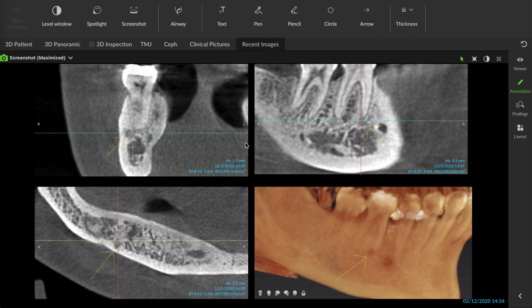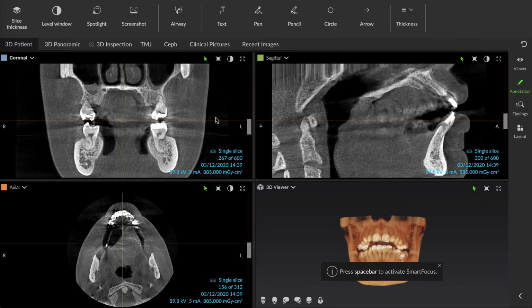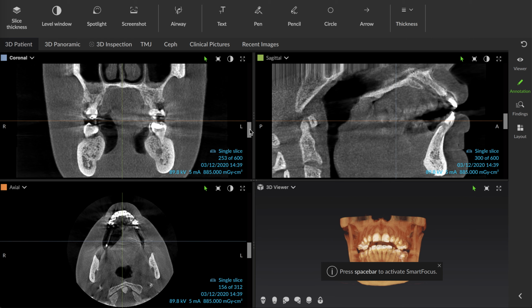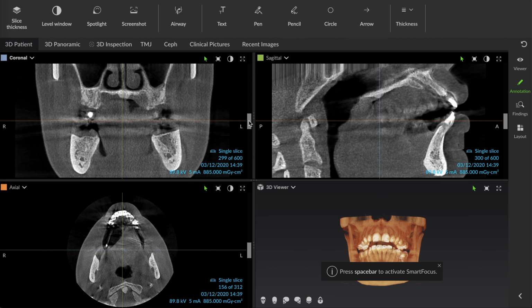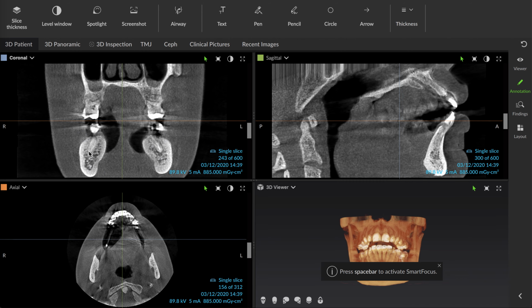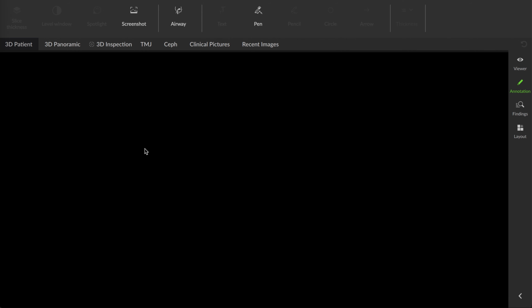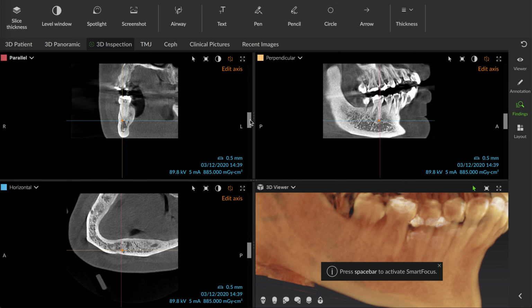On percussion testing, this tooth tested really, really tender. It was very reactive to the percussion testing. And then we did a cold test on that tooth, and it was also extremely reactive. So my diagnosis was irreversible pulpitis, likely combined with necrotic pulp on that mesial buccal or mesial lingual areas, and recommended a root canal treatment. And we started her on antibiotics because she had to get home to pick up her kiddos from the bus.